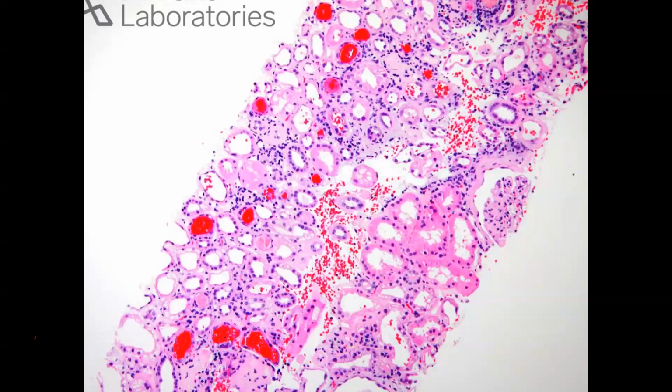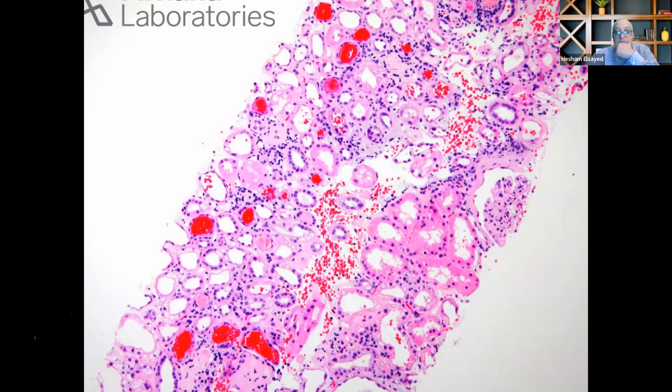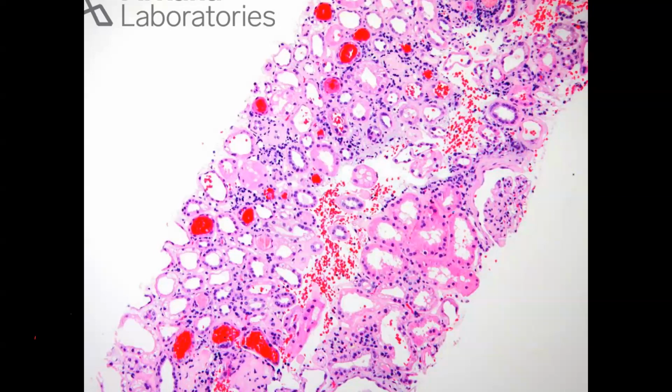If we look at the section in pathology in a certain way, we may find it globular. If we look in another way, you might find it, for example, oval. It depends on the tubule cutting. Yes, it depends on the cutting of the specimen and the tubular structure and shape. Yes. Okay, thank you very much.